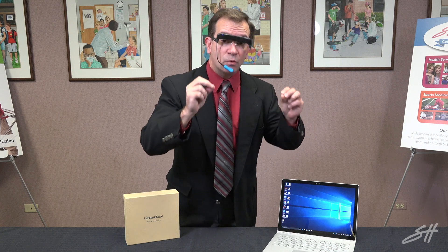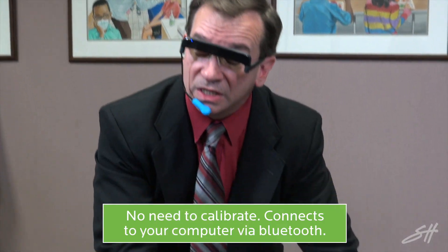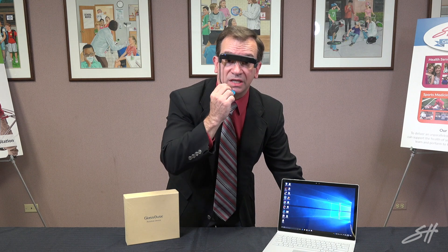This is actually a mouth click, so this would be set in the person's mouth and they would be able to activate their click simply by biting down on it to create that left click. There is no need for any type of calibration with this. Once it is connected via Bluetooth, the individual is able to use it and move it around as they best see fit.